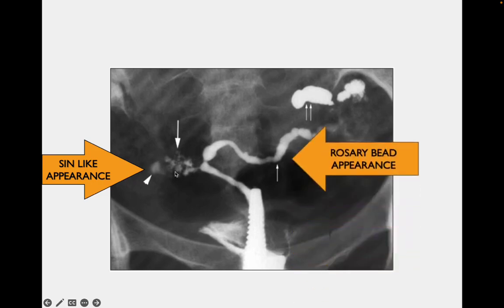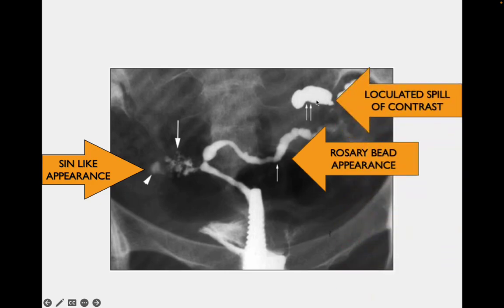Here you can also see the rosary bead appearance. This rosary bead appearance occurs because the tube alternately gets dilated and constricted. You can see constriction here and dilation here, so when contrast goes into the tube, the alternate constriction and dilation gives the appearance of a rosary bead.